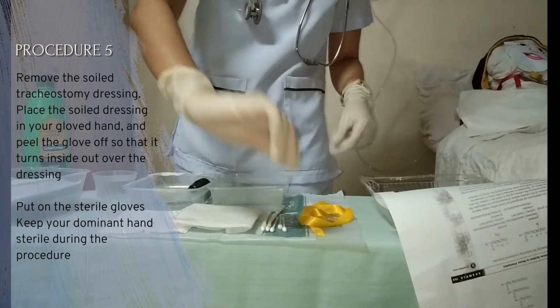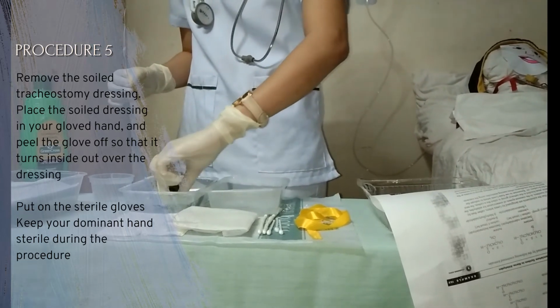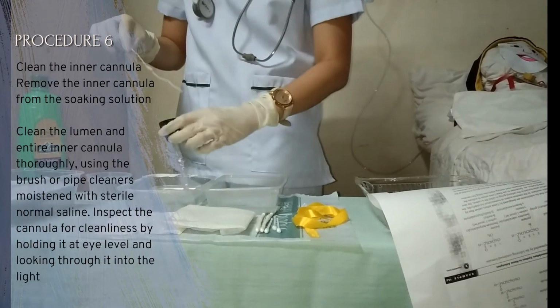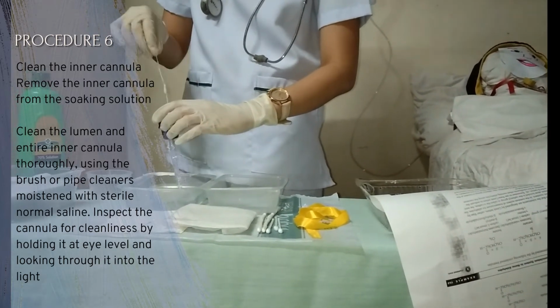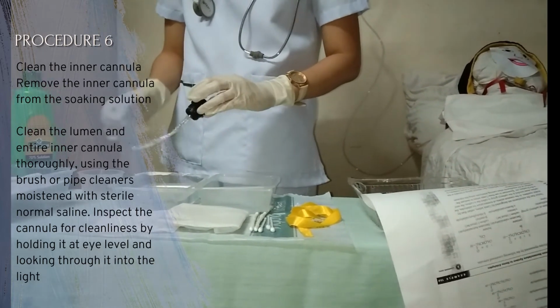We put on again the sterile gloves and keep your dominant hand sterile during the procedure. This reduces transmission of microorganisms and protects the healthcare provider. Now we will clean the inner cannula. Remove the inner cannula from the soaking solution. The solution facilitates removal of mucous secretions and helps prevent infection.